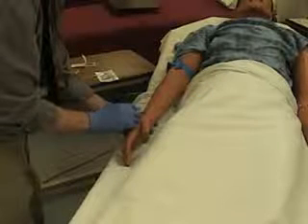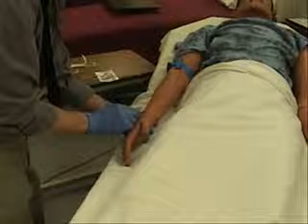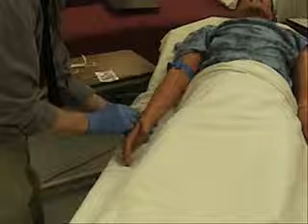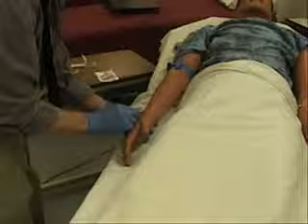After puncturing the skin, lower the catheter to be more parallel with the vein. Enter the vein. You might feel the vein pop slightly, but not always. Once you enter the vein, you will notice blood return in the hub of the catheter. Advance the catheter approximately 2 millimeters. With your index finger on your dominant hand, thread the catheter off of the needle and up into the vein.